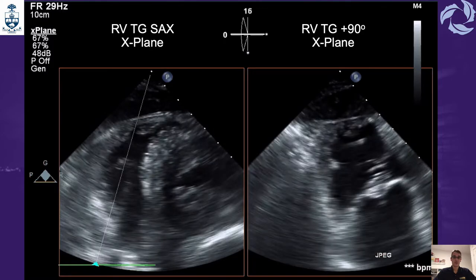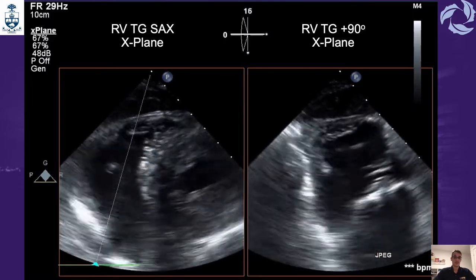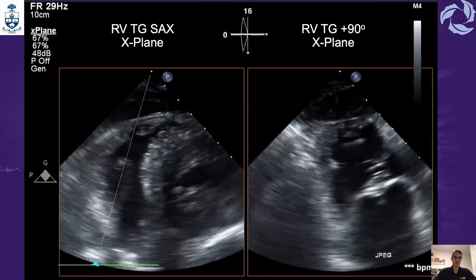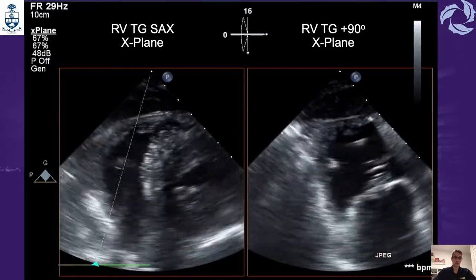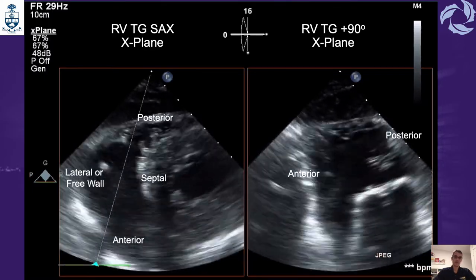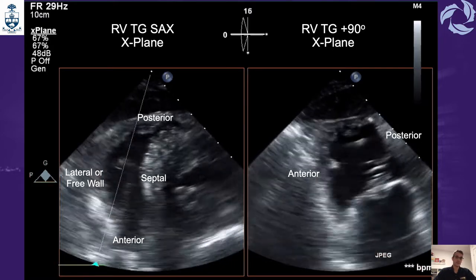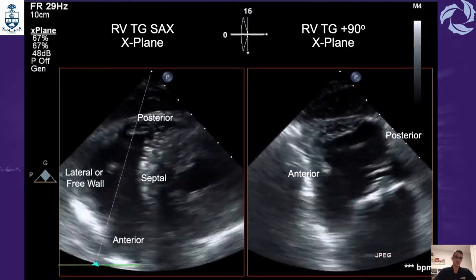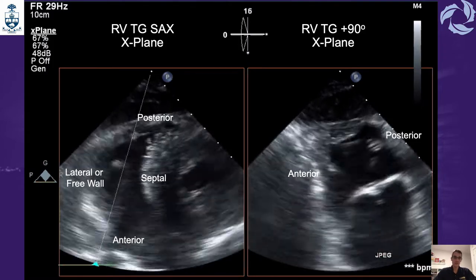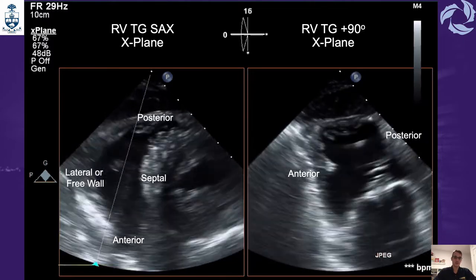From the transgastric short axis modified view over the right ventricle, the same thing can be done. Looking at the left side of the screen we see the RV transgastric short axis. We put the X-Plane in the middle of the right ventricle and generate an image which is 90 degrees from the previous one. In the transgastric short axis we can see the anterior, posterior, septal, and lateral free wall of the right ventricle, while the 90-degree plane shows the anterior and posterior walls of the RV.